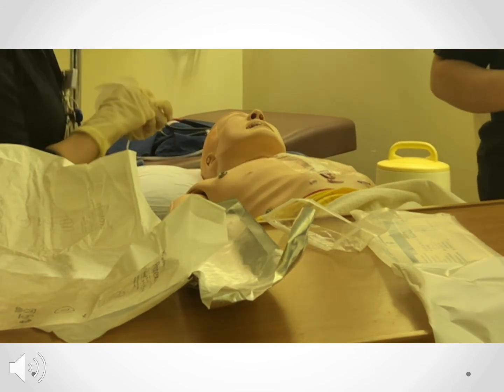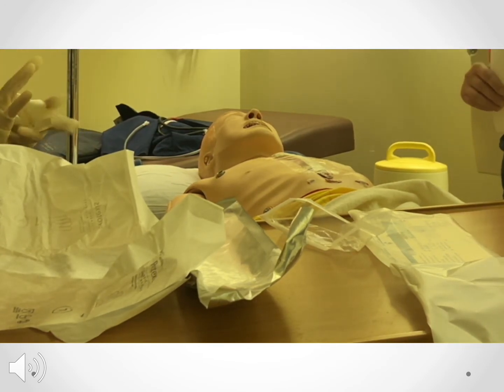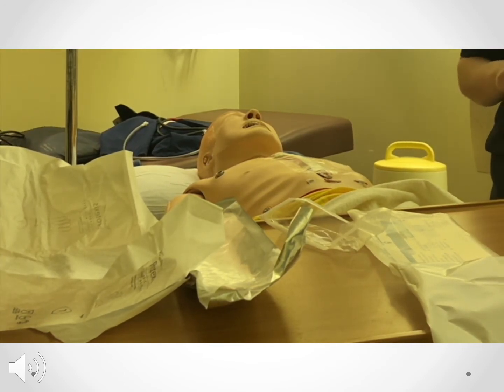And that is our sterile sternal dressing change. Press play, and Katie and Liz will walk you through the sterile sternotomy dressing change process.